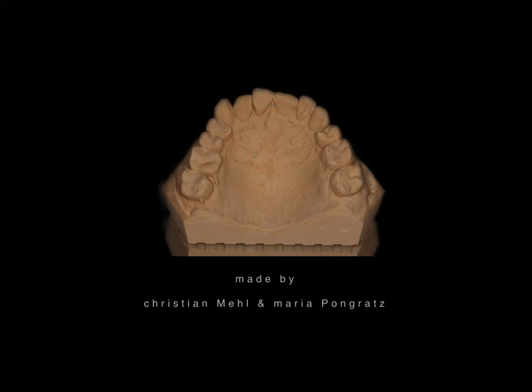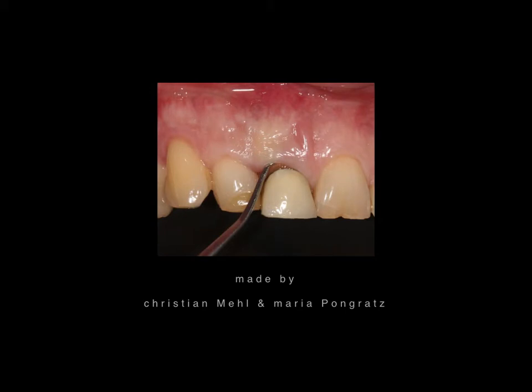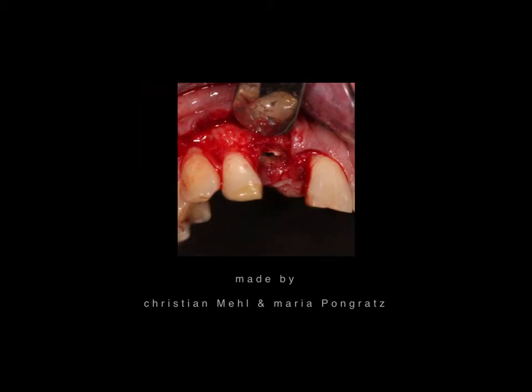We always do the same: take pictures of the situation, analyze the situation, take an impression to produce a model, so that we're able to produce a temporary directly after the surgery. Then, with local anesthesia, produce, in this case, a full flap to have a complete look onto the inflammation, be able to really remove it completely.